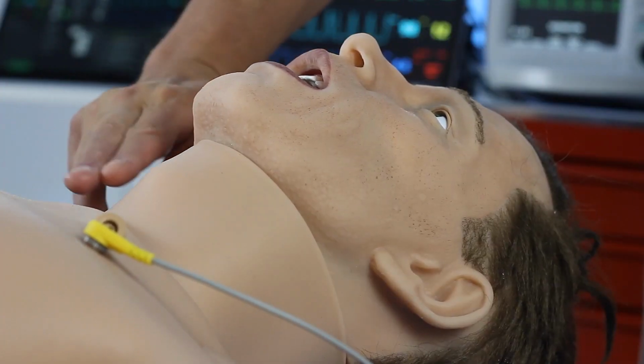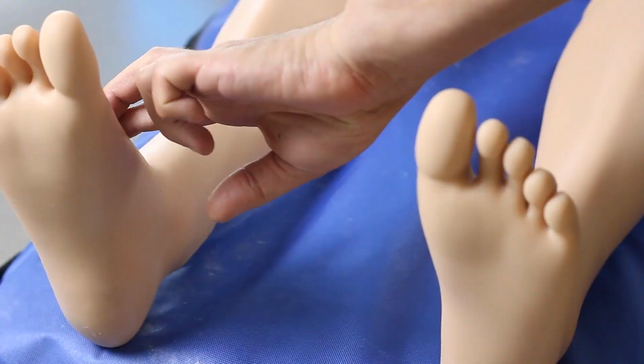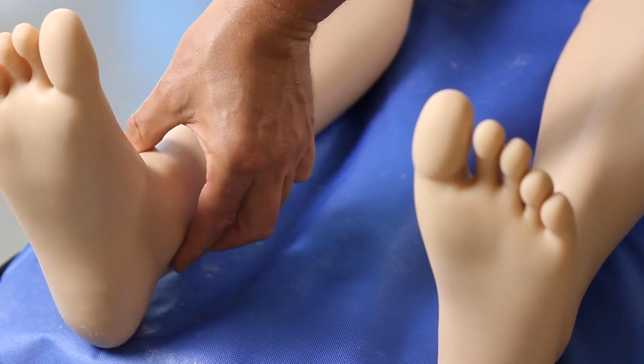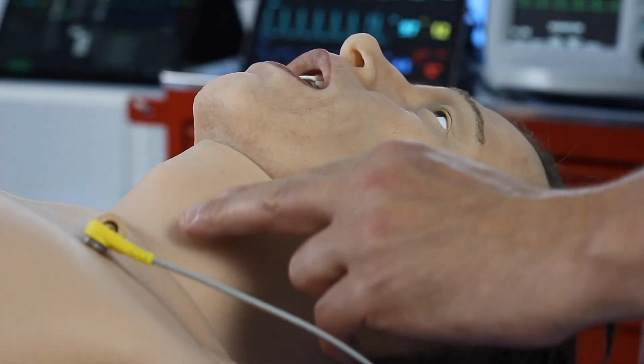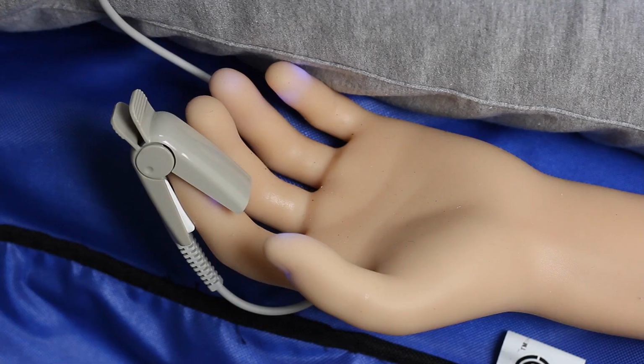Moving on to circulation, Leonardo has 14 areas for taking a pulse. 2 carotid, 2 brachial, 2 radial, 2 femoral, 2 popliteal, 2 pedal, and 2 posterior tibialis. You can also take a manual blood pressure using the blood pressure cuff provided. We can alter the character and the rate of the pulse. We can also remove pulses from different areas should they be required. Again, the cyanosis will give indications of poor perfusion.